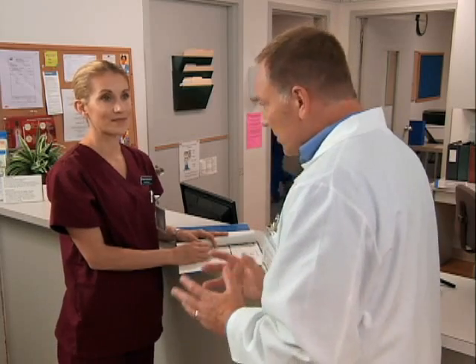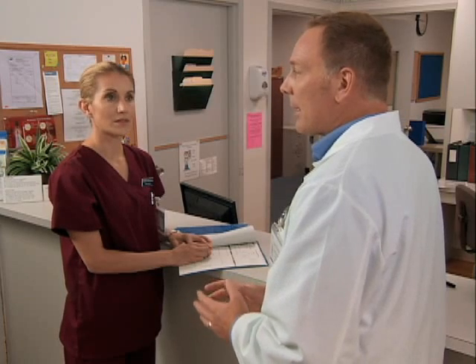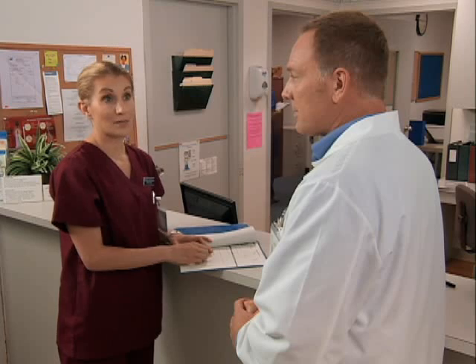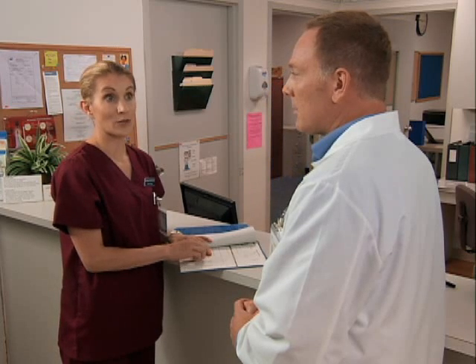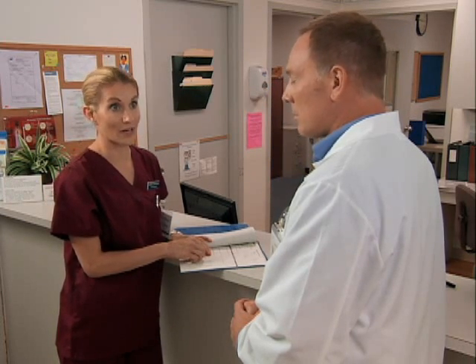Now, there are several steps involved in caring for a tracheostomy site, including replacing the disposable inner cannula, cleaning the stoma site, and replacing the stoma dressing and tracheostomy collar. What can you tell me about each of these interventions? Well, the inner cannula needs to be replaced regularly to prevent accumulation of secretions that can interfere with respiration and occlude the airway. That's right.